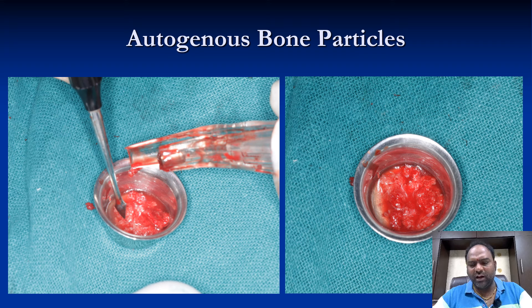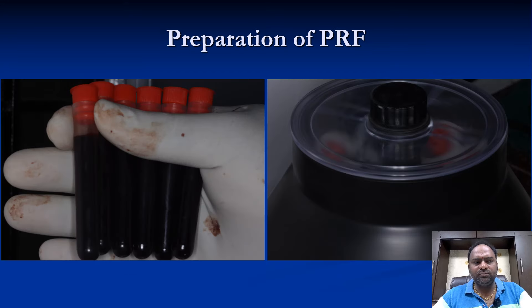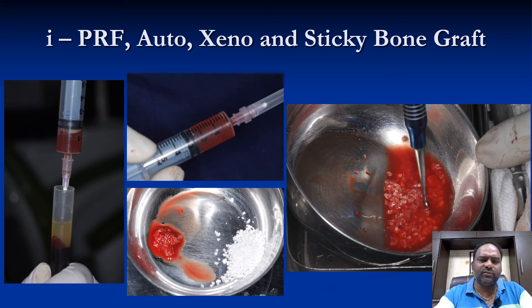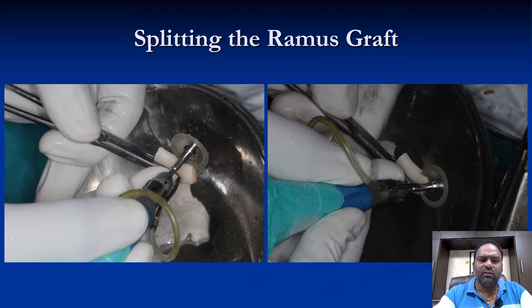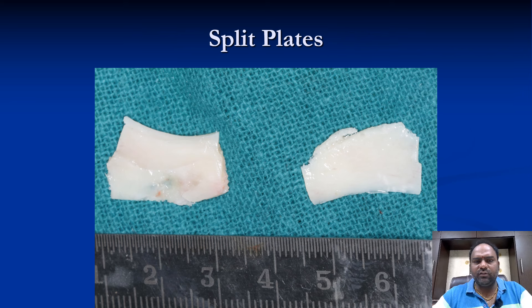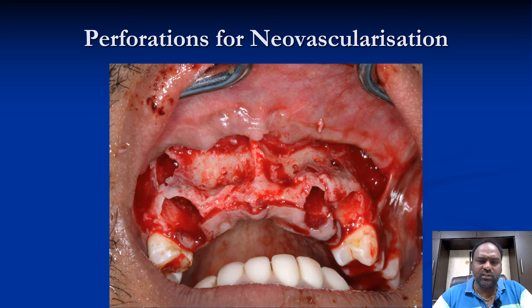We mixed the autogenous bone particles with 50% autogenous bone and 50% xenograft, creating the graft mixture. We then did a splitting of the ramus bone such that the split plates would act as a membrane. We made some perforations in the bone to allow for neovascularization of the bone graft.